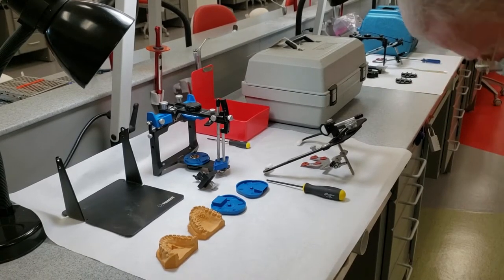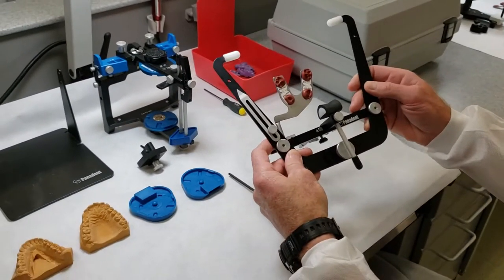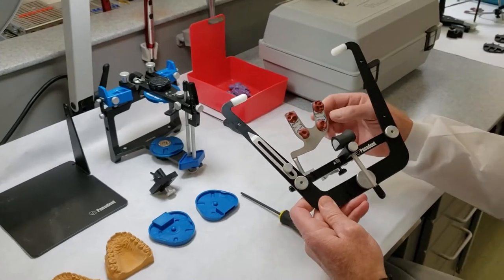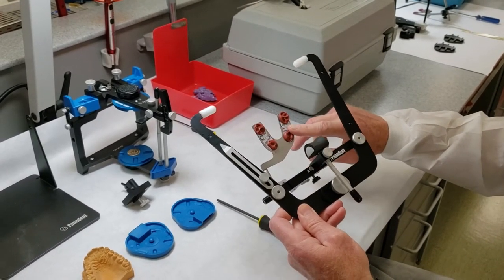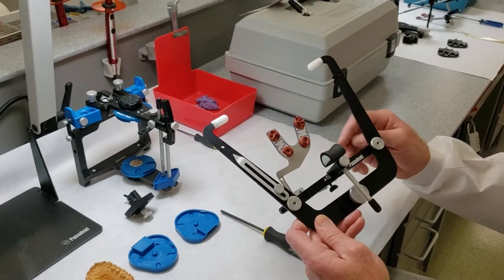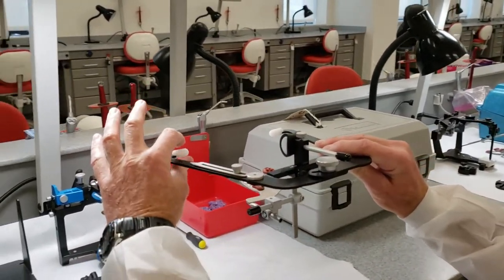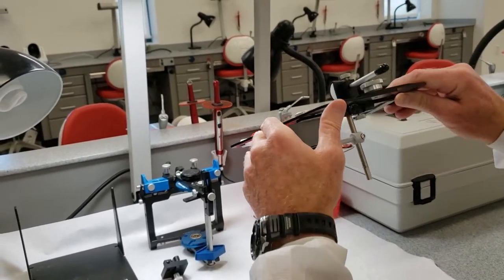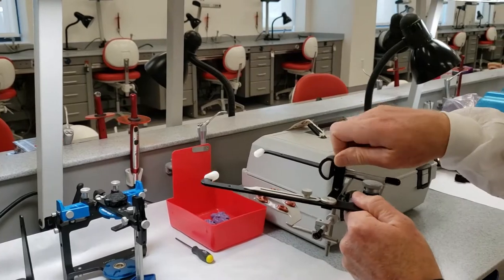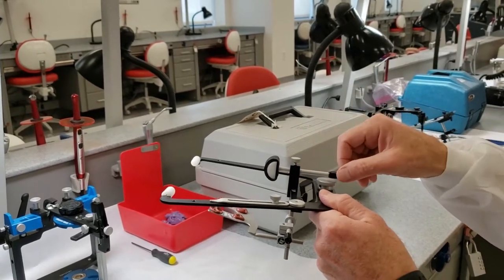Each one of the systems is kind of a variation on a theme. This is the Panadent system, which you're probably most familiar with. The bite tabs we use are just the Panadent tabs. You can use any kind of wax — Aluwax works, any wax that you can soften. These bite tabs are nice and convenient because they're very clean and easy to apply. The bow itself goes into the ear holes, and the vertical positioning is determined by a nasion locator, which goes right at the top of the bridge of the nose between the eyebrows.